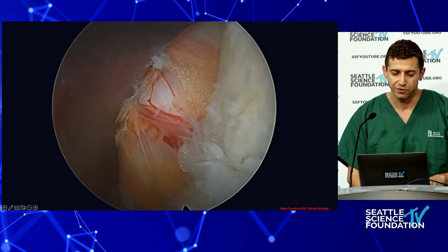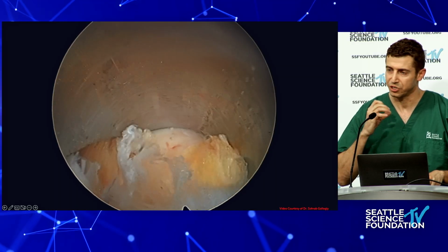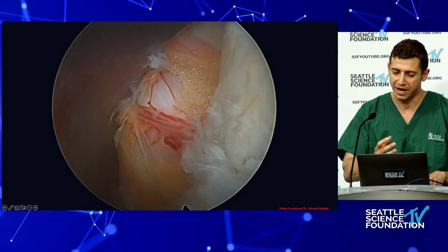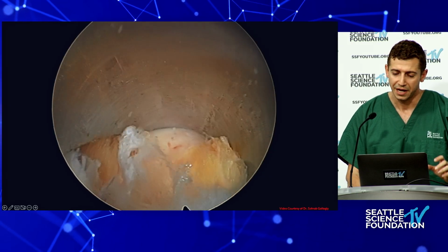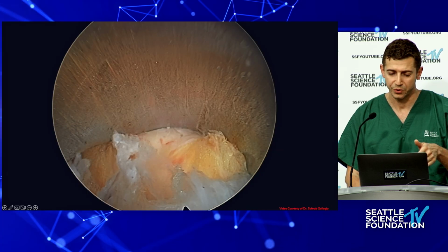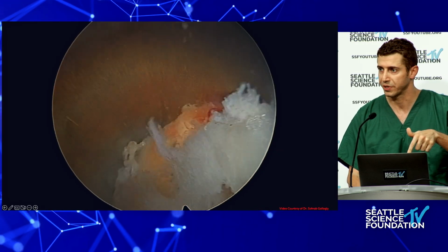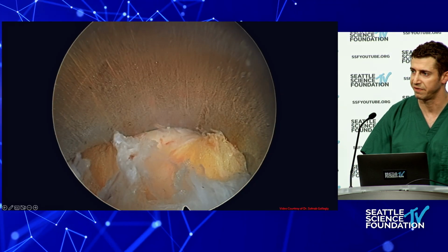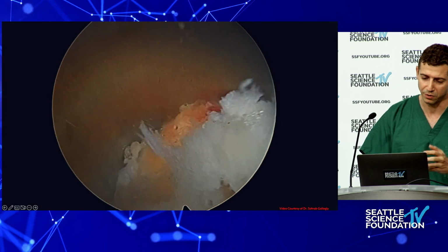And then once your nerve root is mobilizable and you have enough space lateral to it, you can start pushing the working cannula down there and then rotating it to retract the nerve root away. And then now you're right there where the disc herniation is. Let's say, for example, if before doing this you saw disc herniation out there, I would pull that out. Pull whatever you can out before doing this move, because the less stuff that's there, the less likely you'll cause any type of neurapraxia injury when you're rotating the working channel, like what you see here.